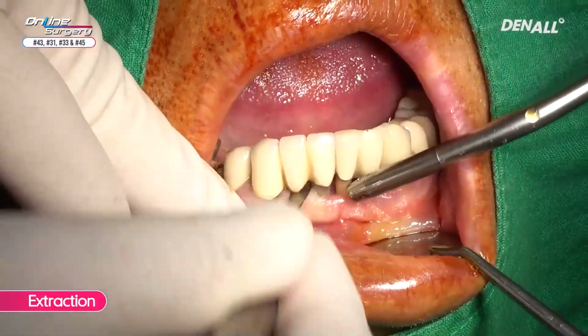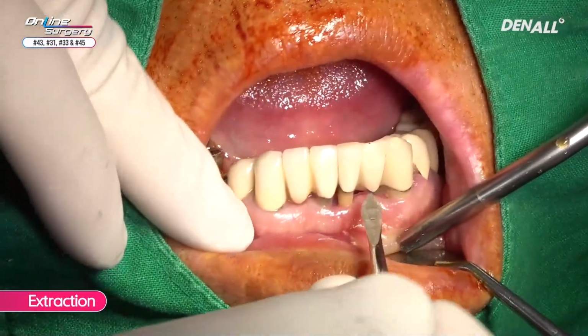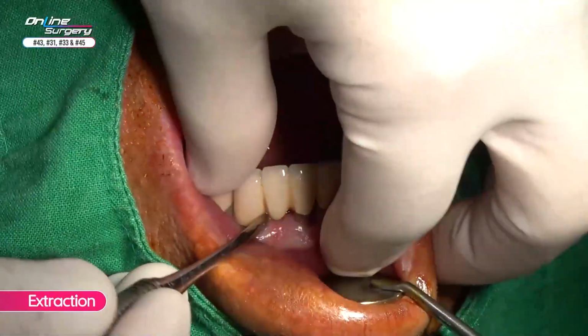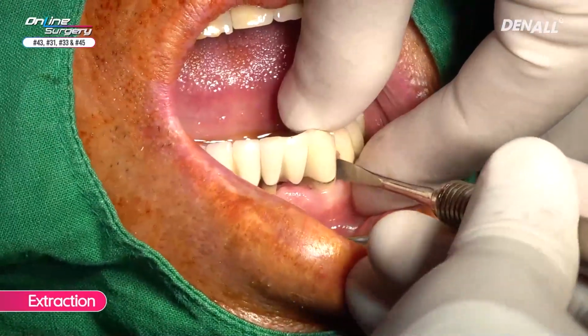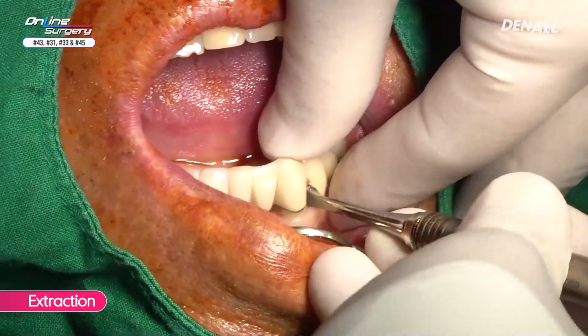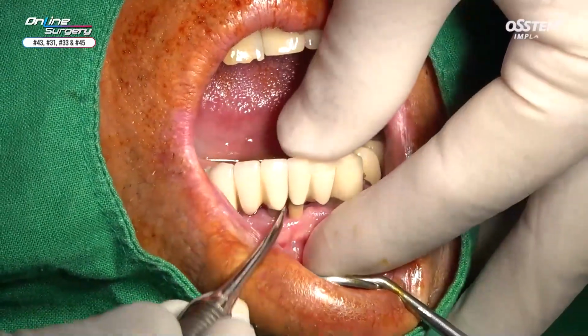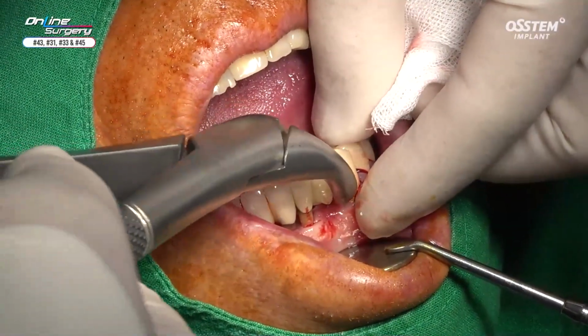I prefer perio steel elevator number 9. Bridge is connected. When you do extraction, what is most important is to get the fulcrum. So bridge is divided in the center.